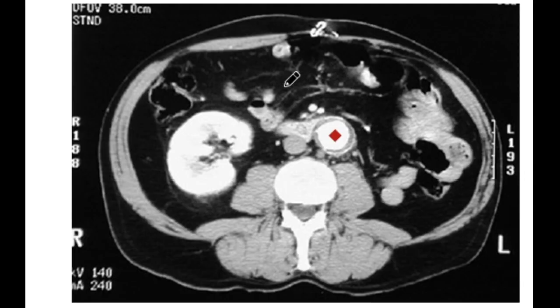Right. So this is the CT scan which is showing atherosclerosis. Here you will see this is the aortic lumen. This aortic lumen has bright attenuation of the blood, and this bright attenuation of blood is surrounded by a darker zone.